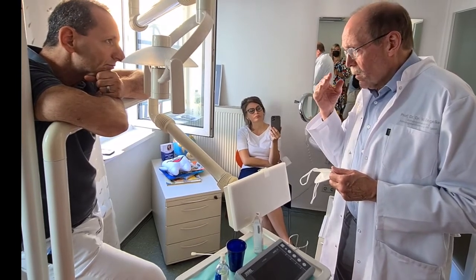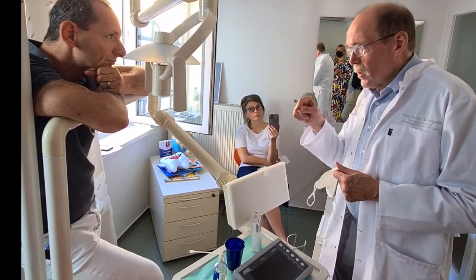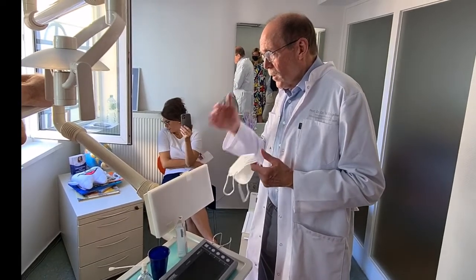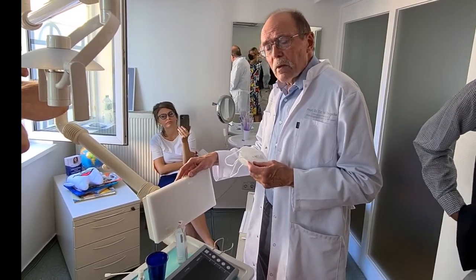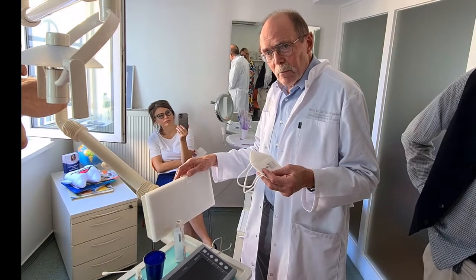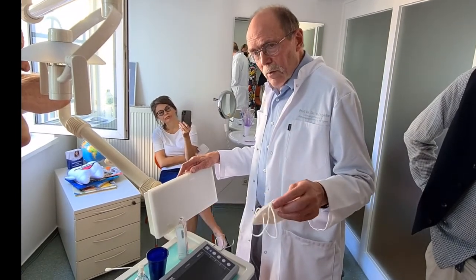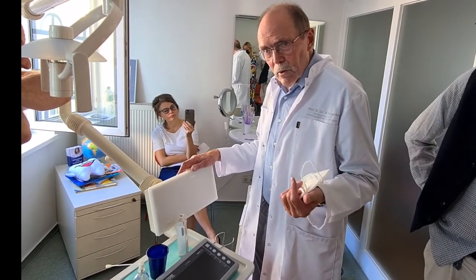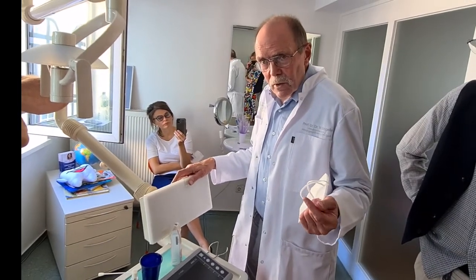The rotation of the mandible has no influence because the tissues which are snoring at the moment are parts of the lateral walls of the pharynx. And please explain how the vertical dimension will influence this point. So it's not the vellum that's vibrating. The vellum is part of the game, but there are more important players and less important players. And as you could hear, although the vellum has been blocked by the activator, there was some noise production still present. And by exclusion of the vellum, we can conclude that the lateral wall has been most influenced in this special case.